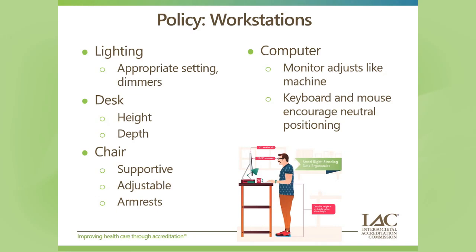And then thinking about the keyboard and mouse, encouraging that neutral position, just like we did when we were talking about scanning, which we'll also dive into later. Getting that neutral position is kind of across the board as far as when we're thinking about working, whether it's offline or with a patient.